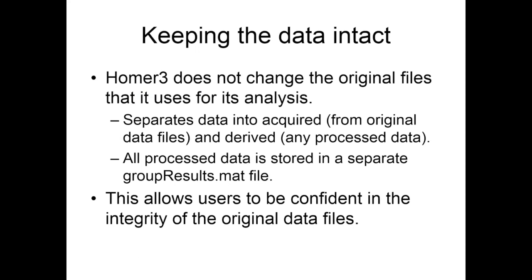Another feature of Homer3 is that it keeps your original data intact. Homer3 does not change the original files. It separates data into 'acquired' and 'derived,' and all processed data is stored in a separate group_results.mat file. This is a safety measure — sometimes during analysis your data can get corrupted. Homer3 will not change anything in the SNIRF files but will create a group_results.mat file to save processed data.